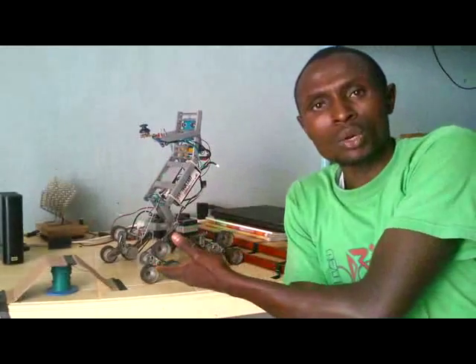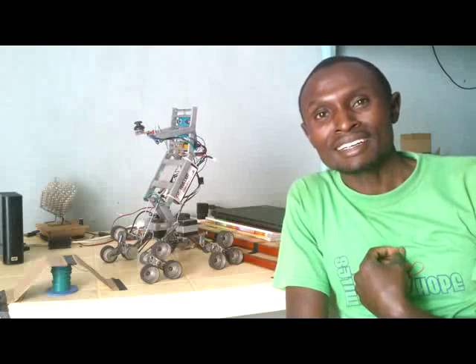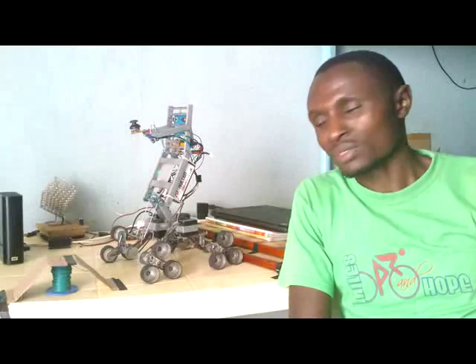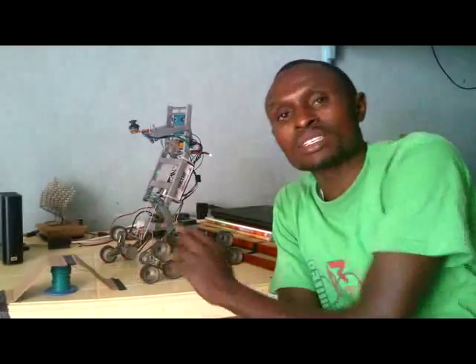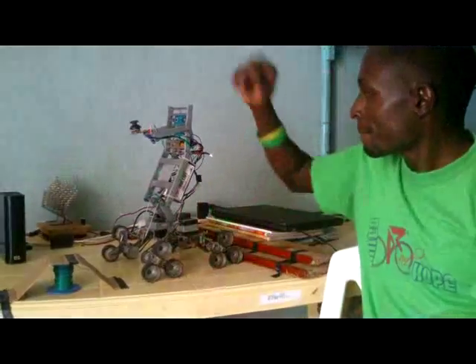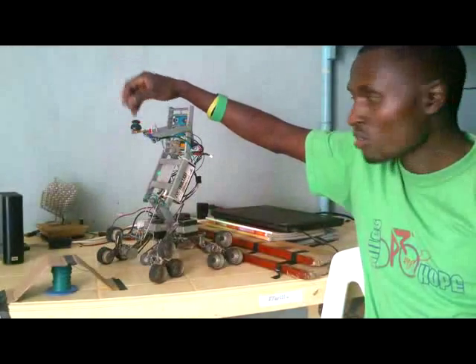So you may be wondering, why tri wheels? Why not a single wheel? Well, that's my own design, and that's after the research that I conducted and found out that this specific set of tri-wheels will be able to go on very rugged terrain, because if this one gets stuck somewhere, the others will continue moving, and I'll show you how in a minute. So steering, it steers on all fours.